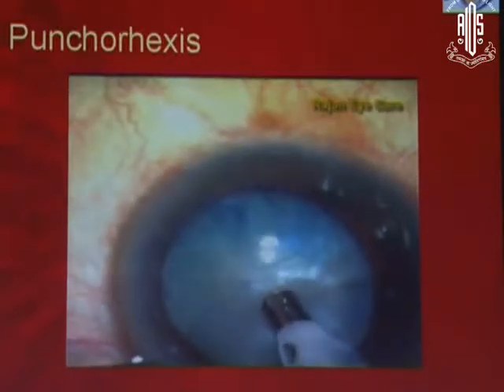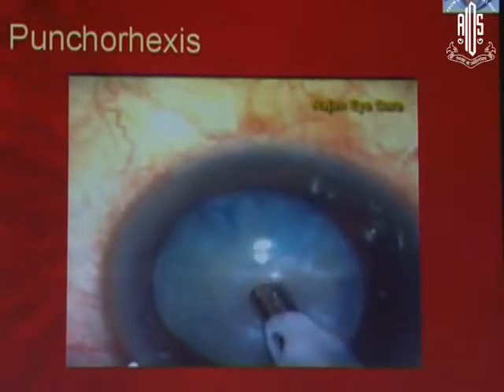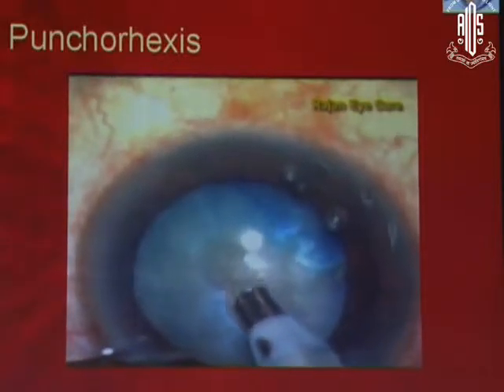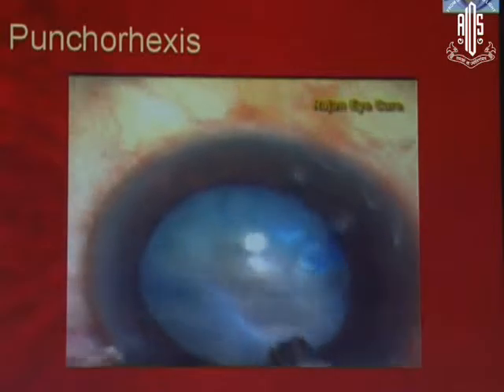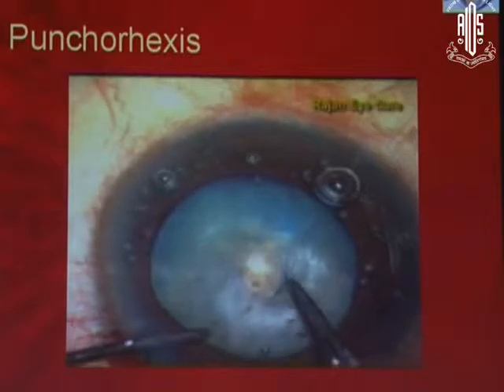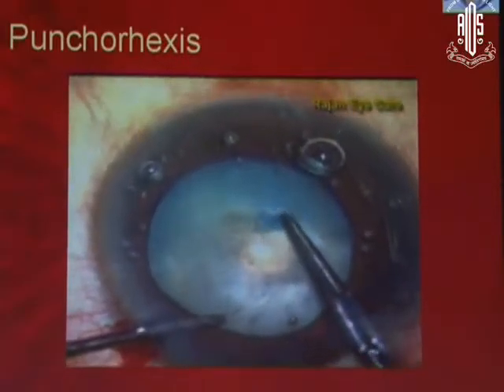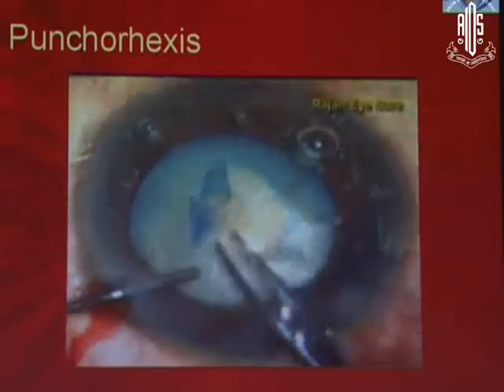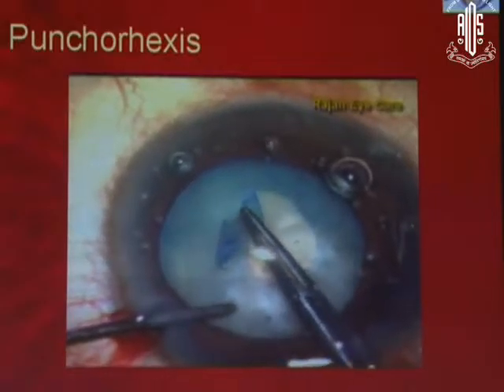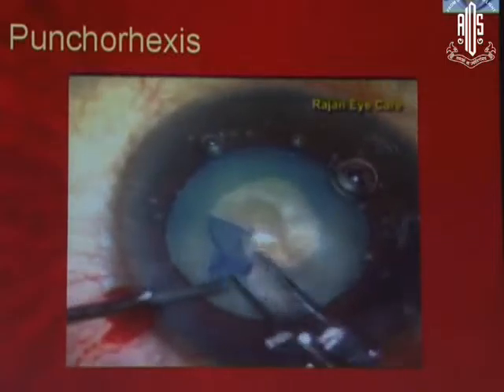You can see one more video where I am using a bevel down fifteen degree tip and if you see very carefully how I am punching it using a burst of phaco with high vacuum. Then once you punch it, sit back and use any viscoelastic — like HPMC — and then you can convert this punched rexis into a regular rexis by using a Utrata forceps or whatever you are comfortable with, using a cystitome, whichever size you want.